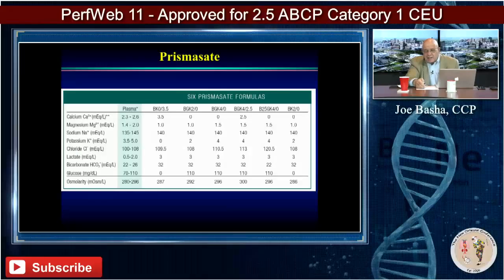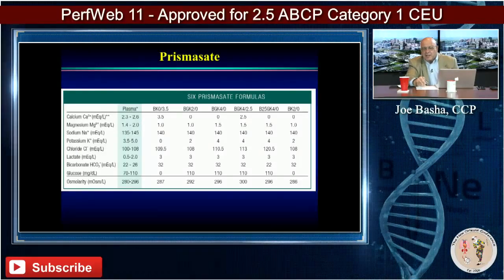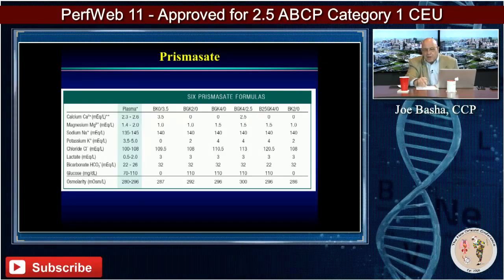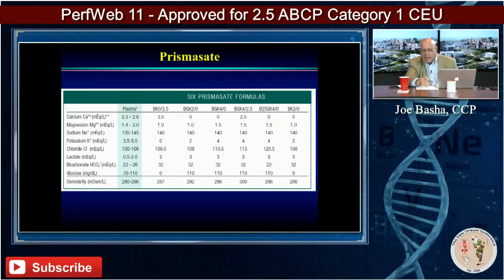You try to reduce thrombogenicity, but everything is thrombogenic on all these foreign surfaces. You have to take that into consideration. These are various formulas. I've actually thought about wanting to use some of this for our prime on the pump, and I'll tell you why.